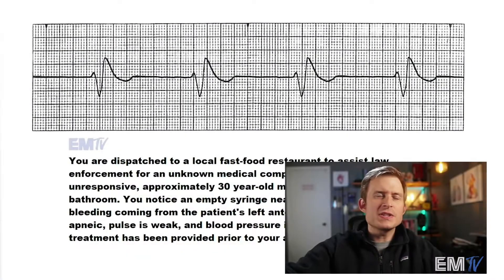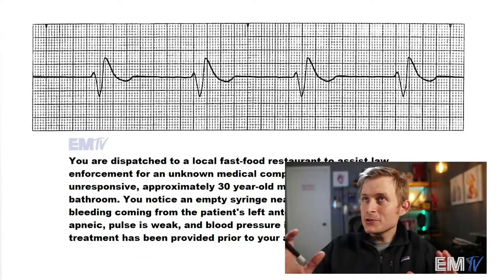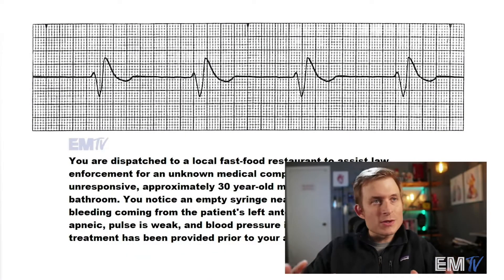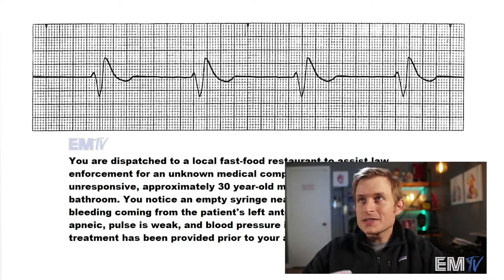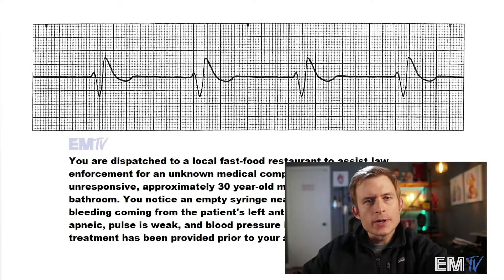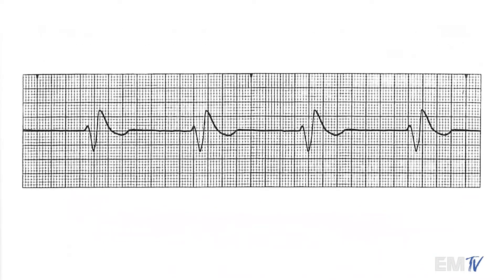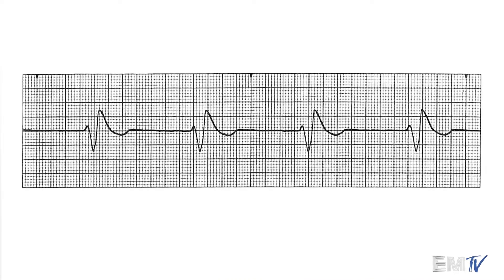So this rhythm is actually deceptively tricky. Let's take a look at it and examine it in closer detail and we'll see if you got it right. First thing you're going to notice here is how slow this is. There are only four QRS complexes here across the six second strip, so this is about 40 beats per minute.